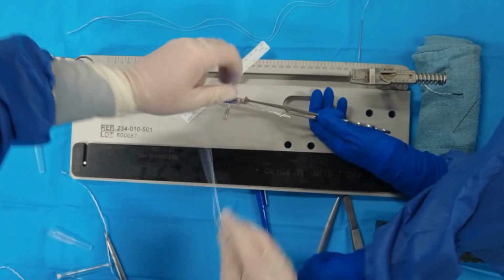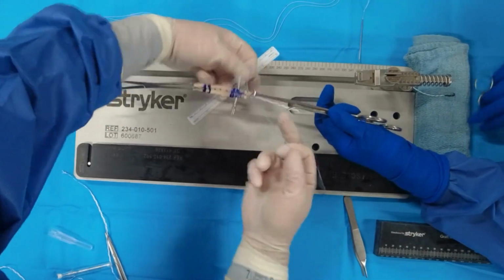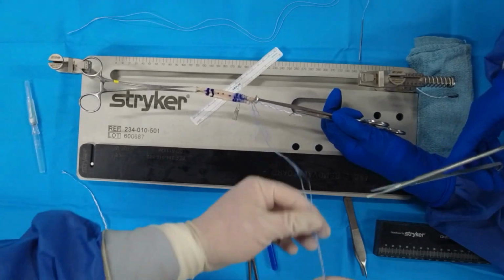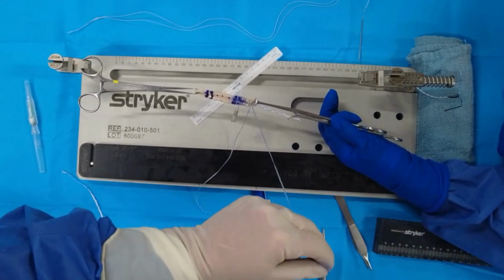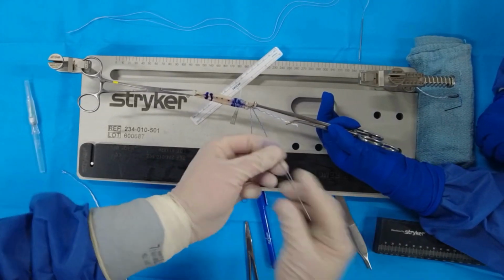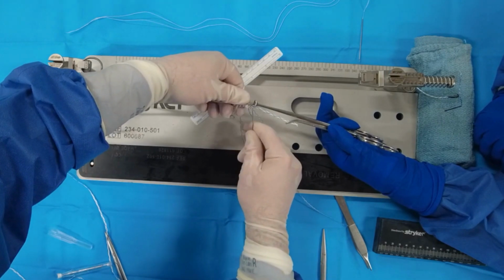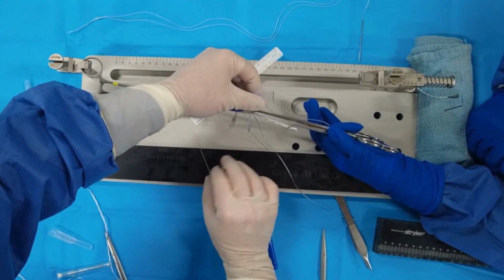You'll see that there's going to be a lot of material at the end of the quad, and there's going to be some dog ears, but this is a good opportunity to use the Keith needle, and we're going to go across this and capture all of that tissue and then tie this in, because it's going to do a great job of bulletizing this and save you some time from having to trim excess tissue out. So I'm going to place that across, and then we're going to tie our knot stack at the end.